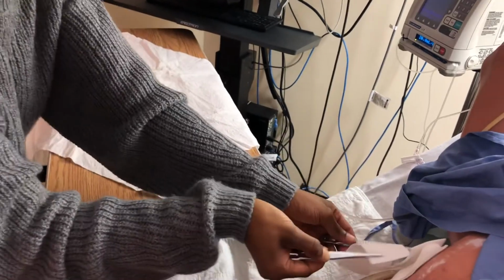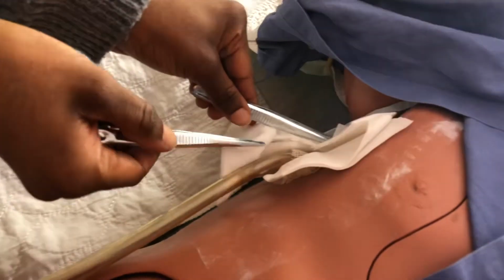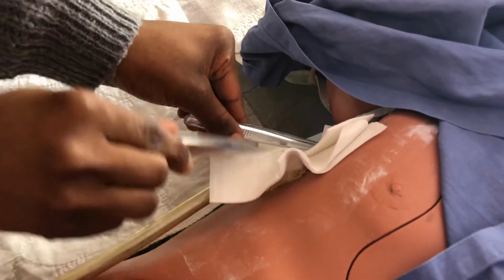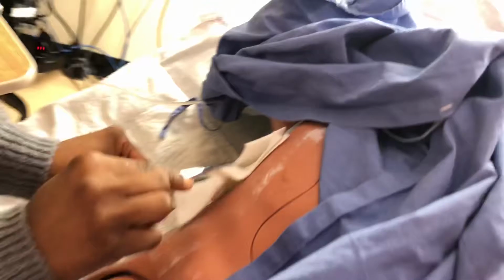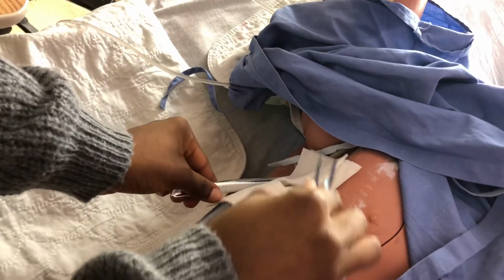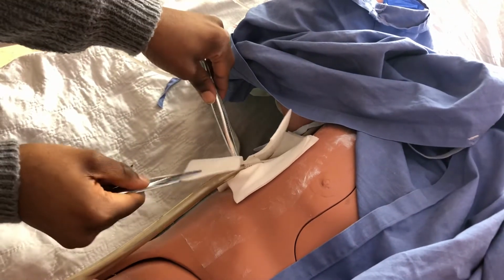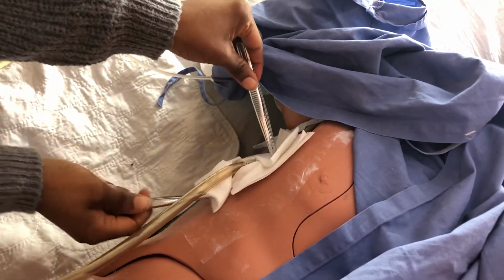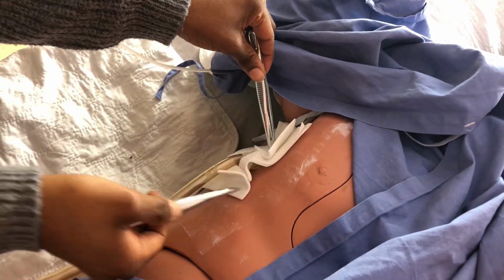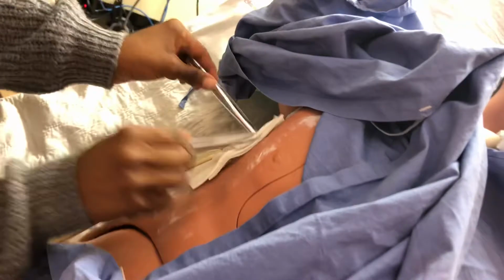Just gonna put this in the opposite direction. And then I'm gonna put it around slowly. And now once I do that, you can put this under. Put in my green bottles. So I put one in one direction and the second one in a different direction. So going in different directions.